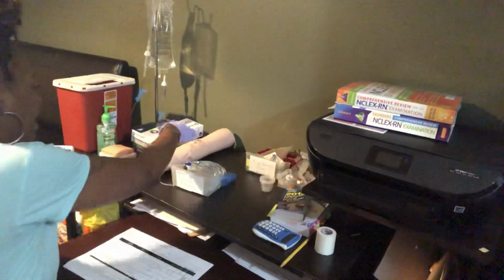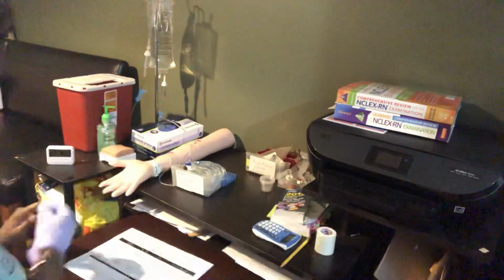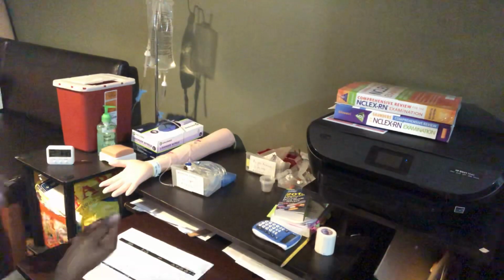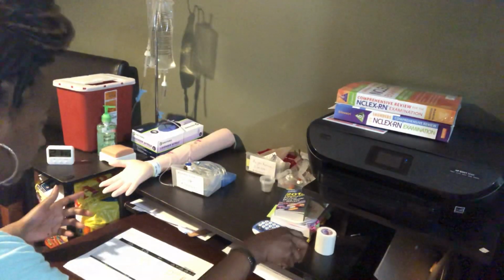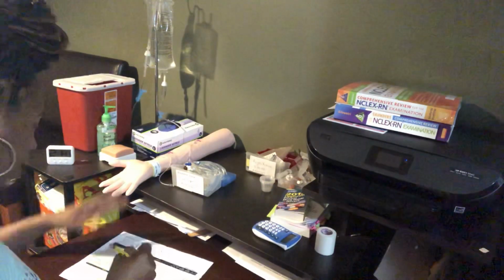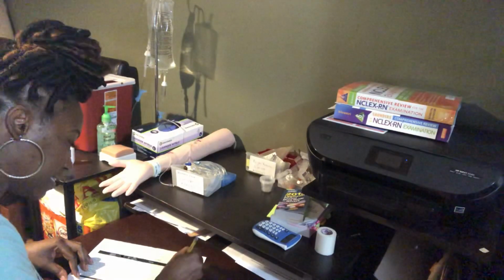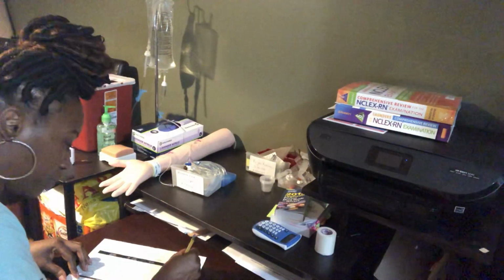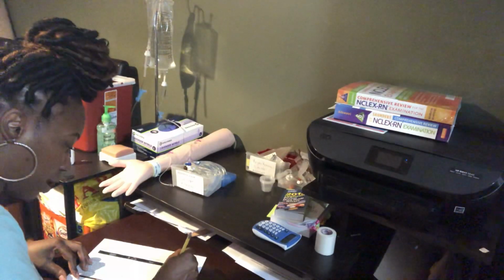So I'm going to check my IV site to make sure I'm even giving the antibiotic and the IV push, because if it's red and edematous, then I'm not giving it. So I can go ahead and do my IV assessment before: non-red, and no swelling.